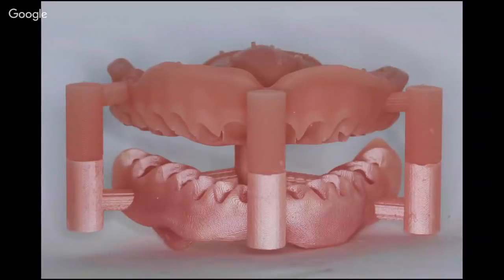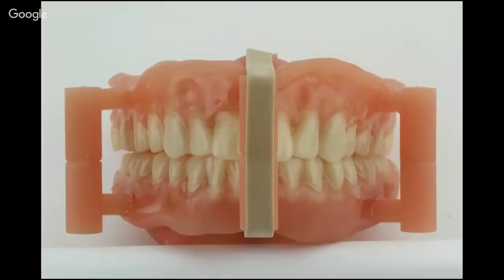So here are my printed bases straight out of the Moonray. No polishing or anything like that has been done to this point. You can see my articulation pins. If I wanted to mount these up on an articulator right now, I could do that. And then once I've done that, you could pop in the teeth here. This is a little out of order. Here is right after bonding in the teeth. I've done no polishing or any kind of festooning or any of that stuff. All I've done is just used the resin, put it into the socket, popped the teeth in, and then cured that. And as you can see, I didn't really change my occlusion much.